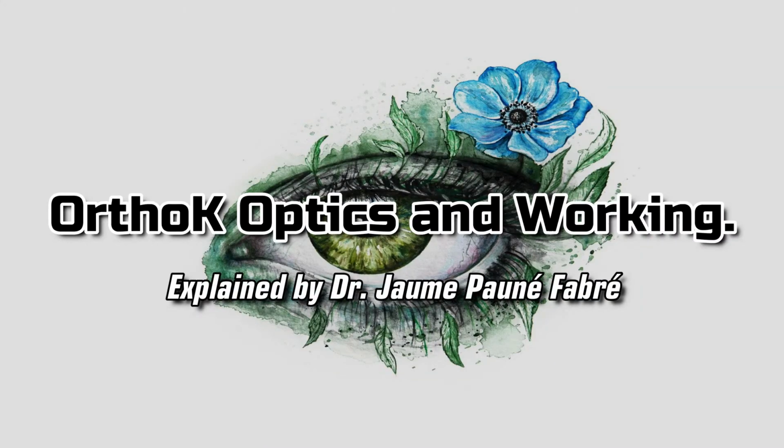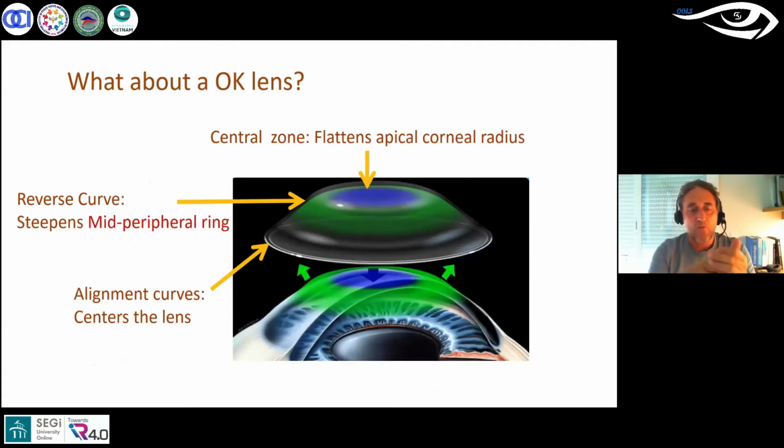Let's do a small piece of the talk about how OrthoK is creating that shape. We know that OrthoK is using a GP lens with the central area as a flattened zone that is intended to correct the myopia, in that case, flattening the central area of the cornea. And there is a reverse curve that is the key of all the fitting, because it helps the lens to land there again in the cornea. And then we have the alignment curve.